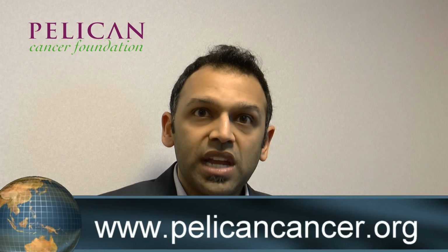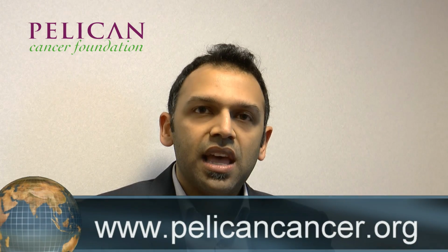A final message is not all nodules in the peritoneum are malignant. So even though we may describe things on the follow-up imaging, they may not be significant or appropriate to that patient's follow-up, and they may not be malignant. Post-surgical changes can look very similar to disease, and that's part of the reason a lot of these patients are followed up.